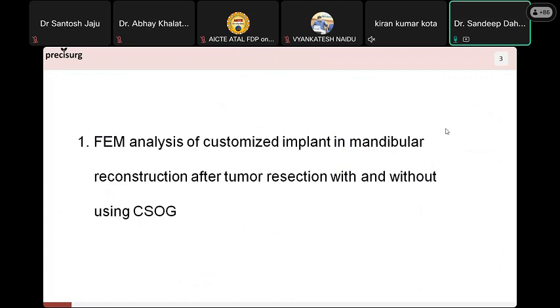All the screws, whatever screw locations and screw fixing he had planned when developing the implant, were not at all possible because of the huge gap between the implant and the bone. Why did this happen? This happened only because of improper cutting of the tumor section.